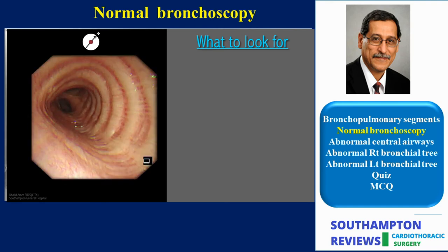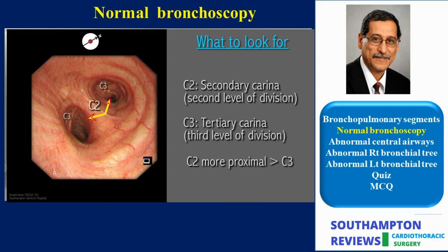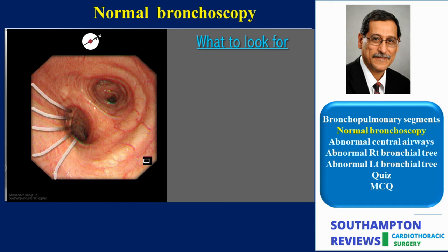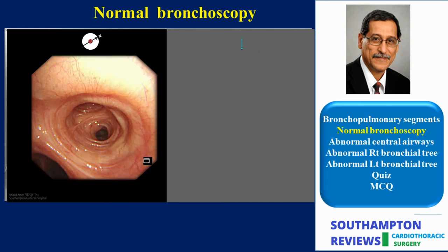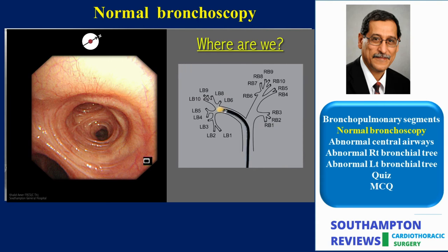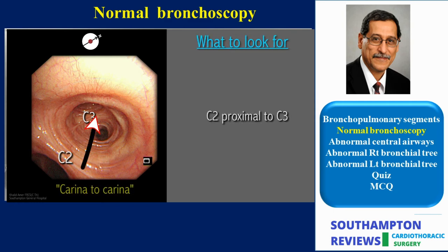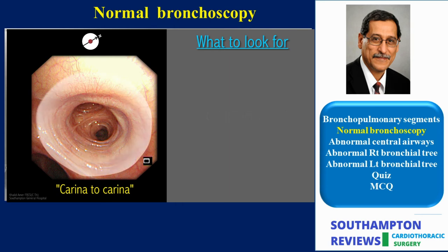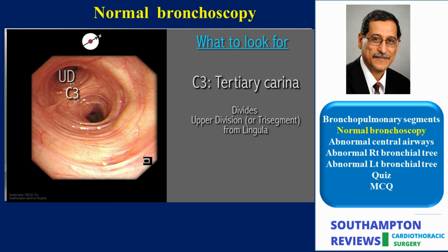On introducing the scope further down the left main, we first make note of the sharp secondary carina C2 between the left upper and lower lobe orifices. Also note the more distal origin of the tertiary carina, which divides the segmental bronchi. The membranous part, as always, will lead us into the lower lobe orifice — this is an important sign and I find it very helpful when confused about orientation. On advancing the scope into the upper lobe bronchus, note is made of the carinae first to define inlet and outlet. Here again, the surface area from carina to carina makes up the upper lobe bronchus. On approaching the upper lobe divisions, it's important to identify the tertiary carina C3 between the upper divisions and the lingula.